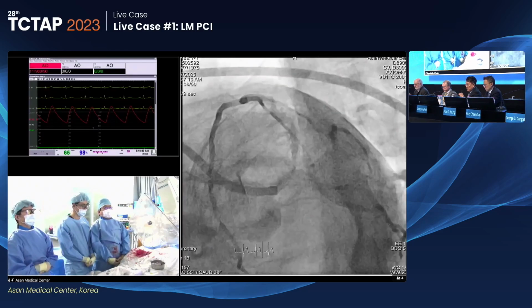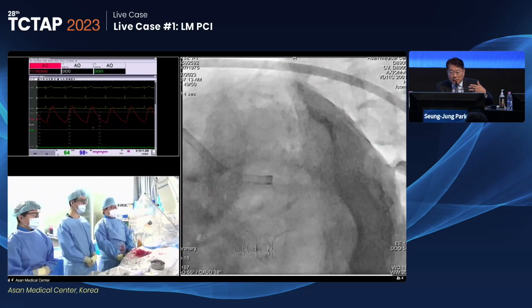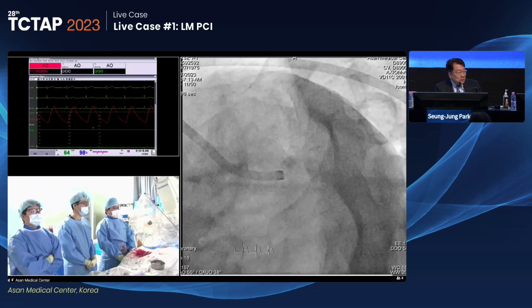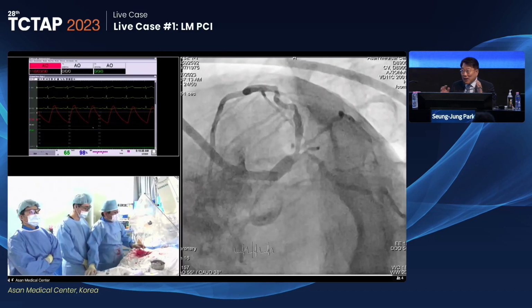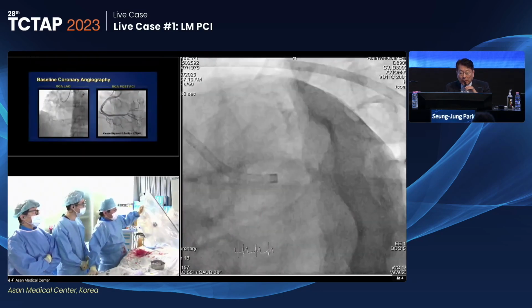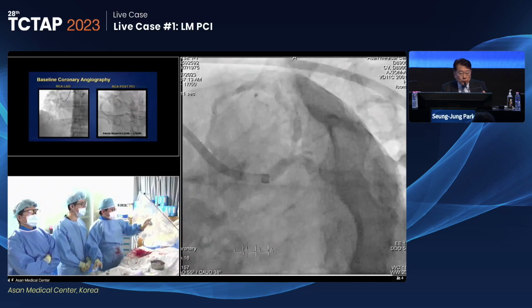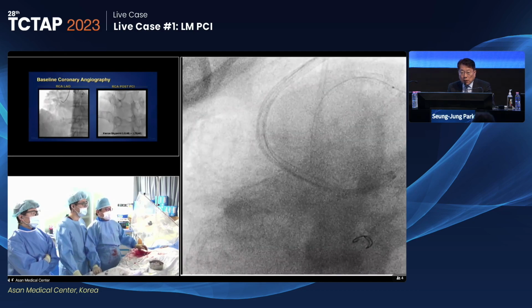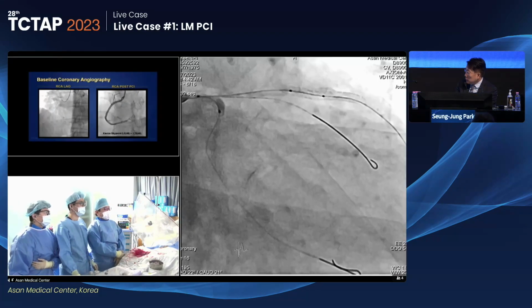All right. Anyway, in fact, this kind of left main lesion intervention is our daily practice, right? However, I would ask the panel, total occlusion, bifurcation, truly tough, including the first diagonal branch. So is he a good candidate for surgery, Antonio?